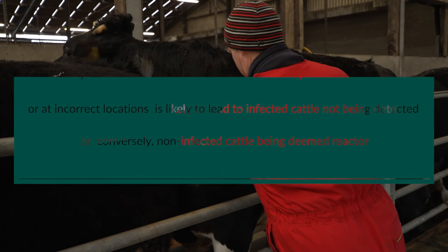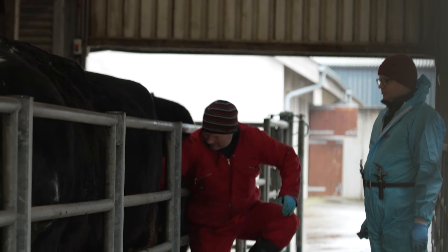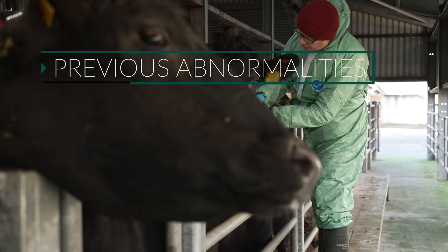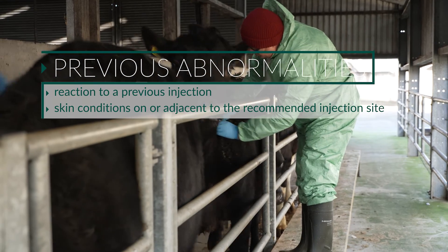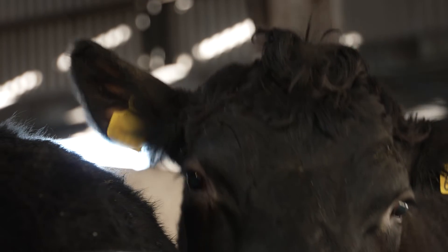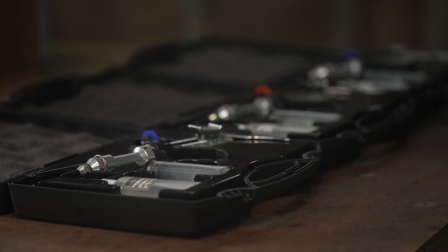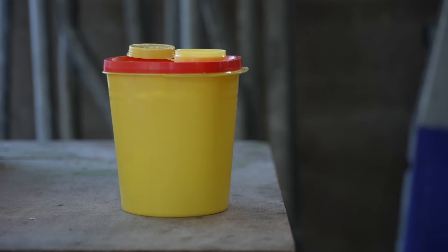Should a testing veterinary practitioner encounter an animal with a dirty neck, a thorough cleansing of the injection sites should be completed before injections are administered. Occasionally, a veterinary practitioner may encounter an animal with localized abnormalities — such as a reaction to a previous injection or skin conditions on or adjacent to the recommended injection site — in which case the other side of the neck should be used where possible, and the details recorded. Should the syringe fall or be compromised in any way, the spare syringe should be used for the remainder of the test. Alternatively, the compromised syringe can be cleaned, repaired, and the needle replaced before use.